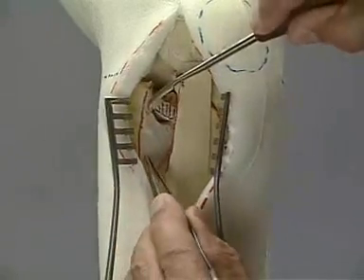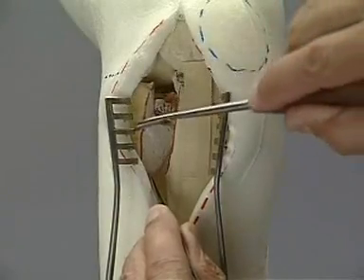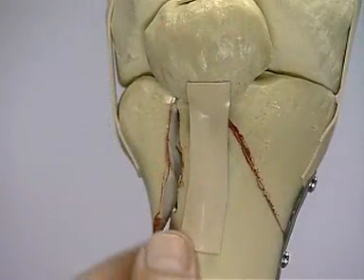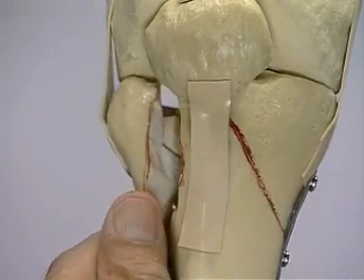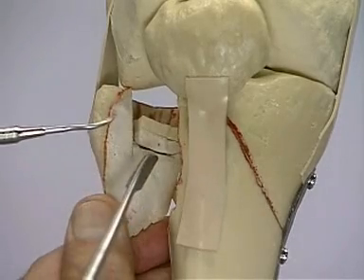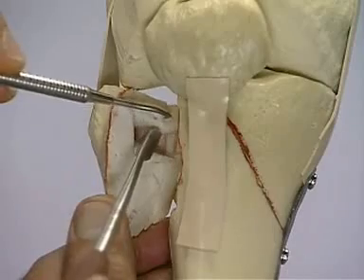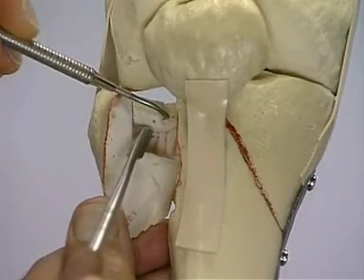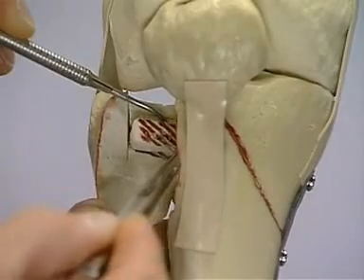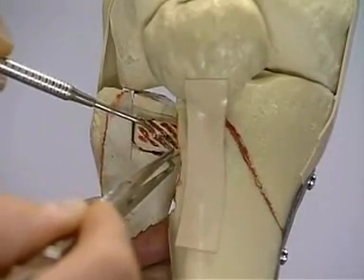To fully appreciate the extent of the damage to the lateral plateau, the condyle is now gently opened through the anterior fracture line. Next, the most central impaction is elevated with a pusher. The metaphyseal bone defect is filled with cancellous bone, or preferably a bicorticocancellous autograft from the iliac crest, which can be shaped to give a tight fit providing good mechanical support.